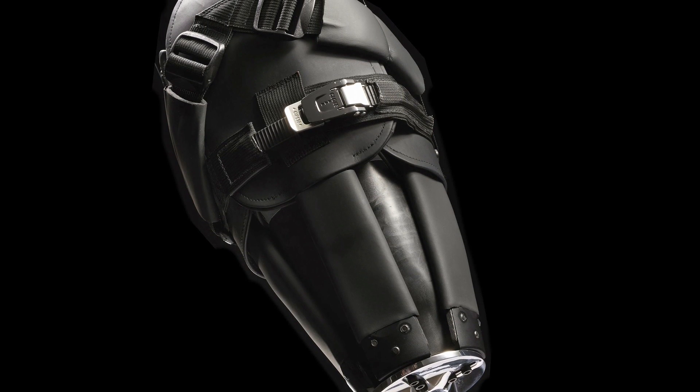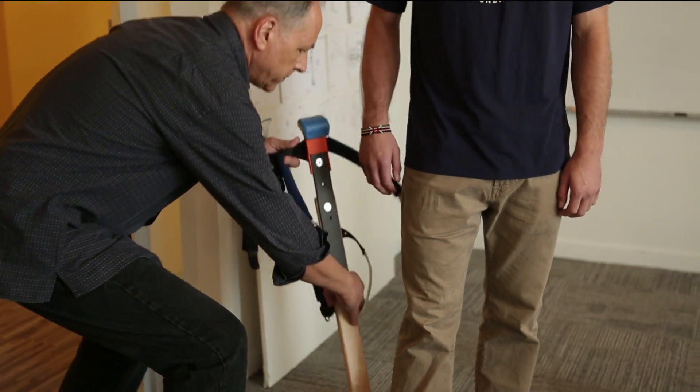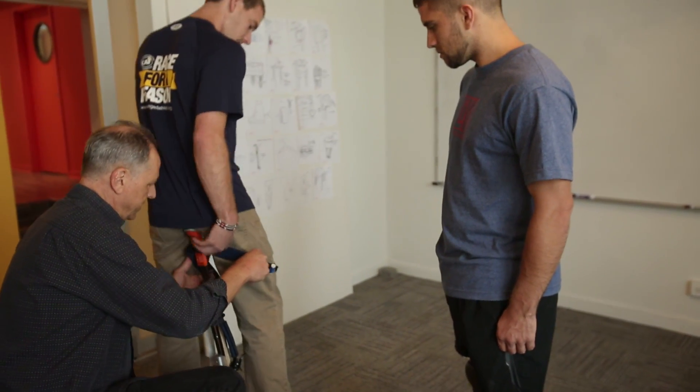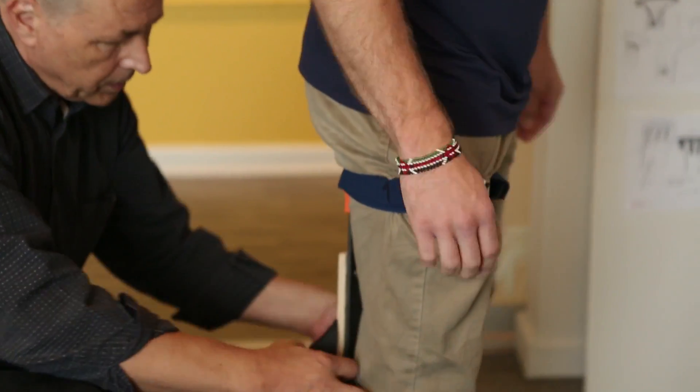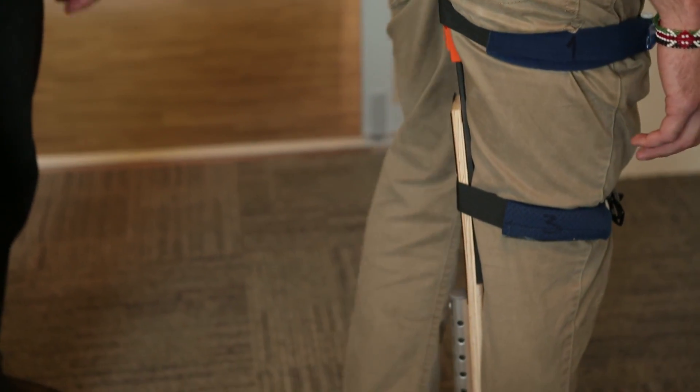In many cases, designers try to put themselves in the place of the user. Let's say you're designing something for somebody who is blind — you might be able to close your eyes and imagine what it might be like to be blind, but you can't take your leg off. So we built this rig called the empathy rig. What it does is give designers who are not amputees insight around what it's like to carry the weight of your body up under your tailbone.